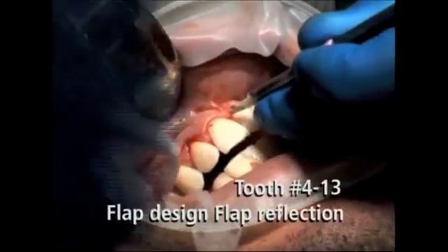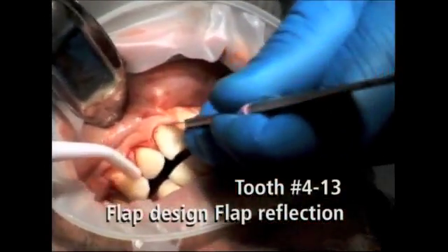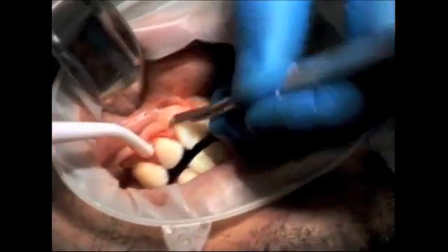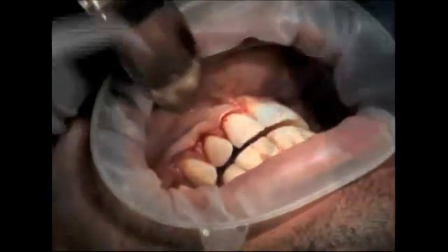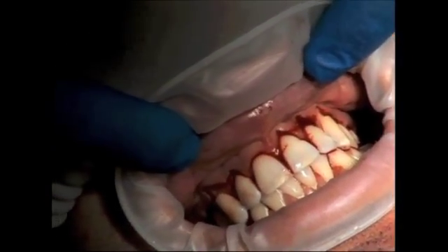For this patient's case, the incision design extends from tooth number 4 to tooth number 13. Once the crestal incisions have been completed, two vertical releasing incisions are made to aid the flap release and passive closure.